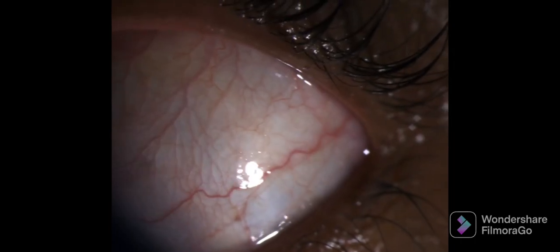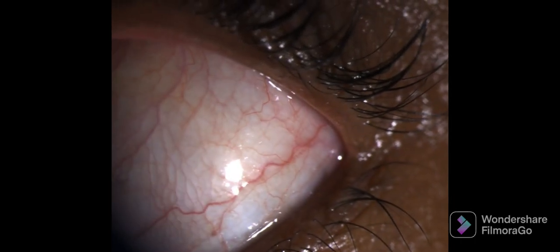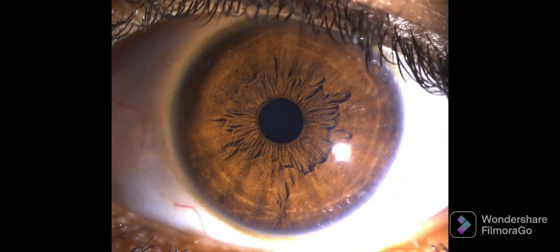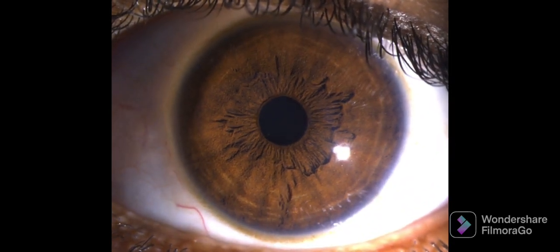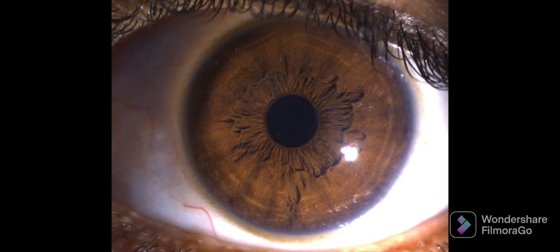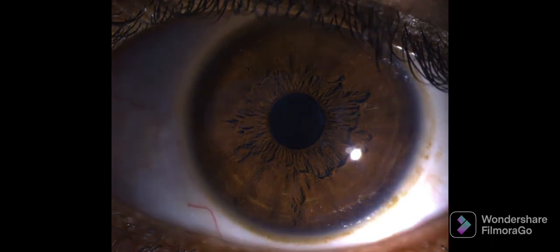If there is any dilation, the sign will change. The next structure is the cornea, which is examined for its transparency, and the iris for its normal color and pattern.